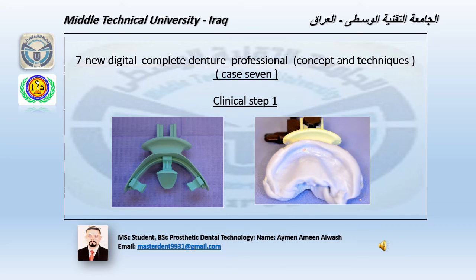Number 7, new digital complete denture professional concept and technique. Case 7. Clinical step 1. We use the traditional way to record the primary impression by using alginate impression material.